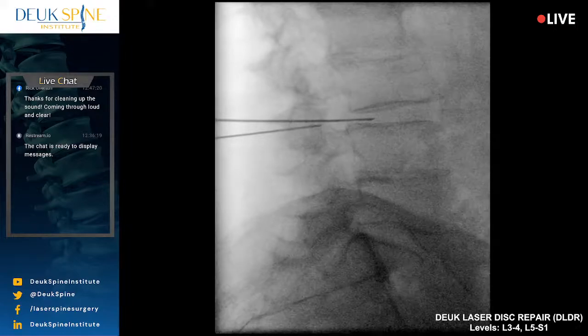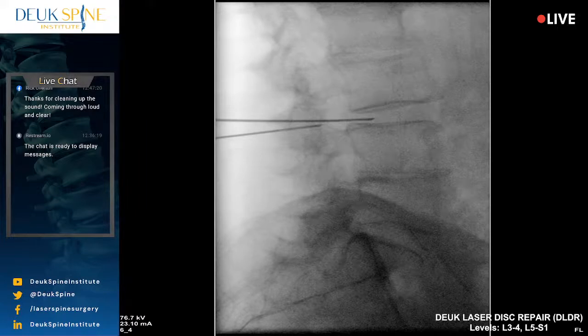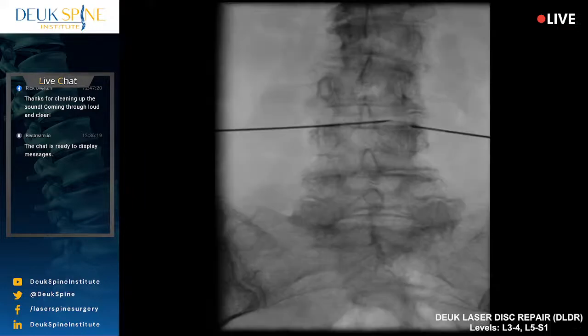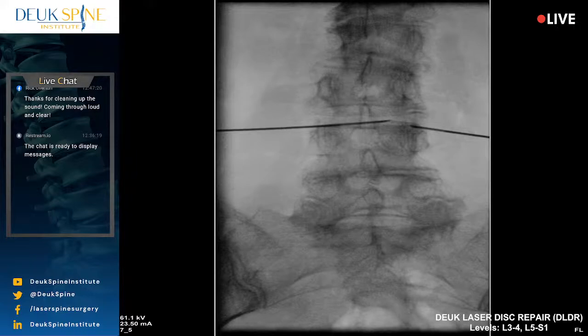Unfortunately, there is pain, some discomfort with the beginning of this type of surgery when you're awake. Let me just go a little further and then we'll get an AP. And I can feel the needle passing the facet joint. But before we go any further, I want to verify my position on AP to make sure that I'm not too lateral, too far to the side, which I'm not. It's perfect. All right, and that first needle you can see went across midline. That's fine. That's good. I've got a good reach. So I'm going to be able to clean out the back of this disc very nicely.